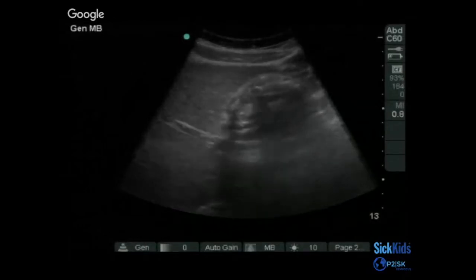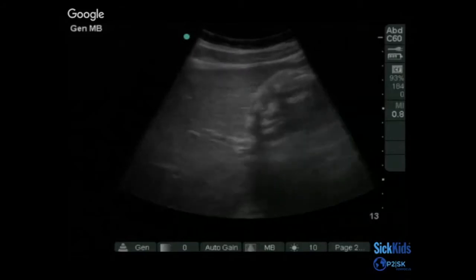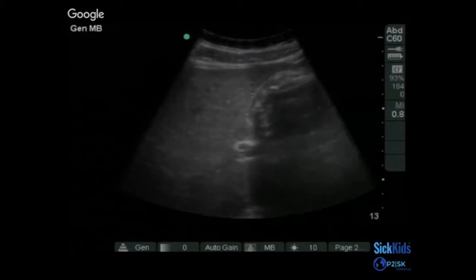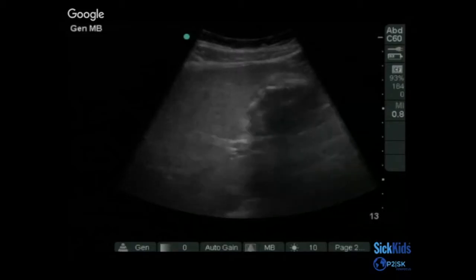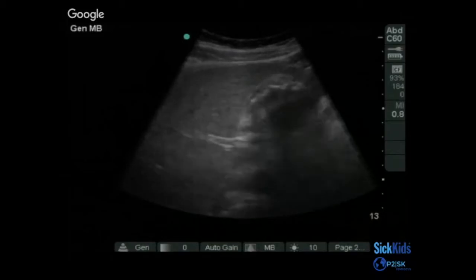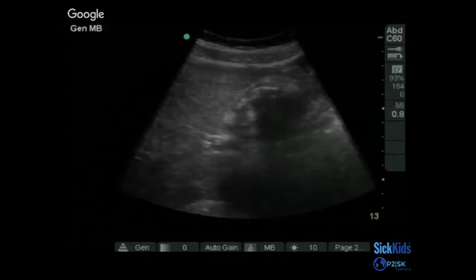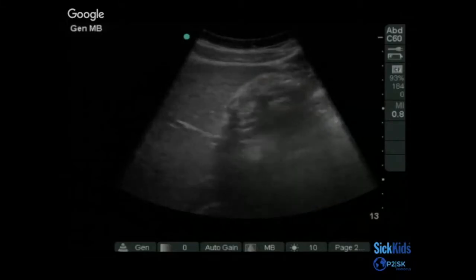So how does this fool people? And how is it a pitfall? Often people will overlook a WES and say it's going to be a false negative because they misidentified a collection of stones simply as bowel gas, or just overlooked it because they've never found the gallbladder. Okay?